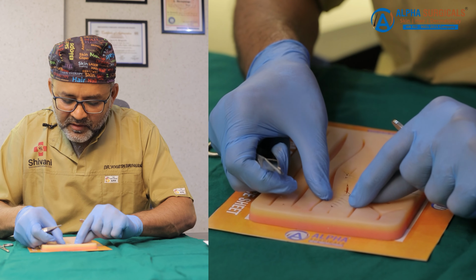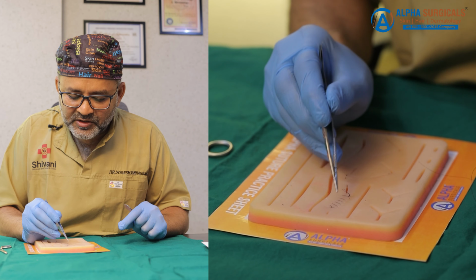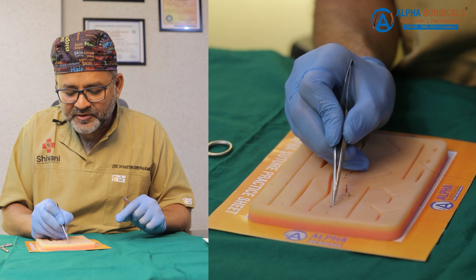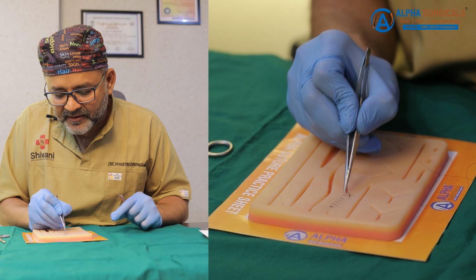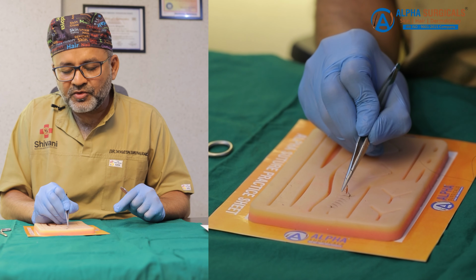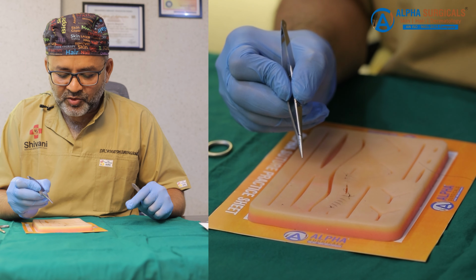As an analysis, on either side there is a knot created to hold the suture material, and in the central part there is an oblique line of the suture we can see, which is the running of the thread. It will give you closure of the wound in a linear pattern, no overpressure created, and we can see there is no wound gap. It holds the tissue for 7 days, and 7 days is the time of suture removal.